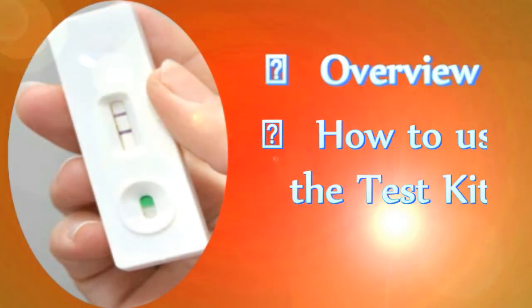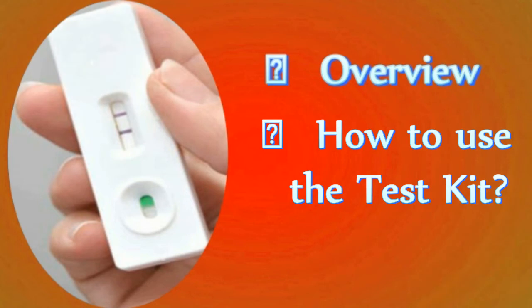How to use the test kit. To perform a test for pregnancy at home, you should use your very first urine in the morning. This urine contains high concentrations of HCG, and therefore, it gives you the most accurate result.